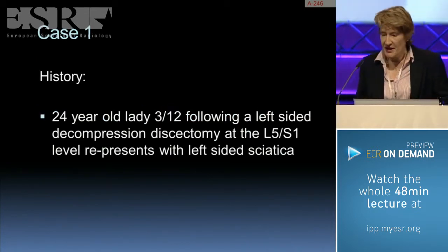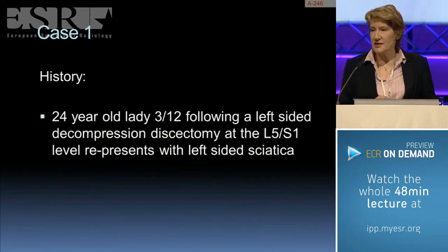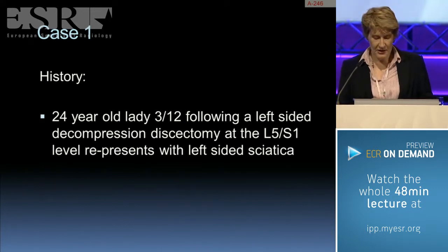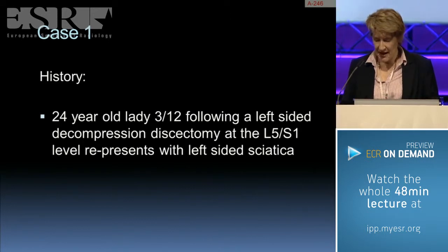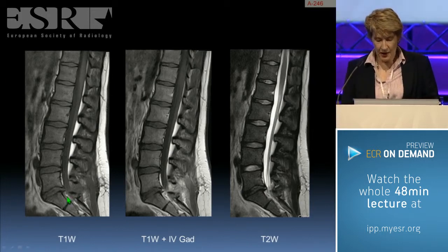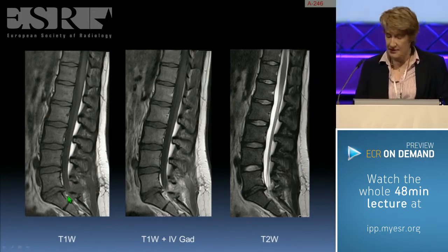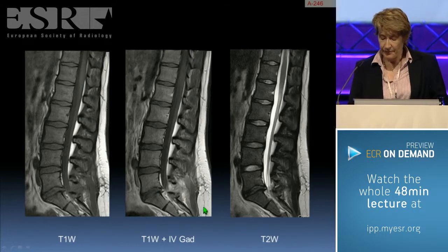The first case is a 24-year-old lady, three months following a left-sided decompression discectomy at the L5-S1 level, who re-presents with left-sided sciatica. Here you can see the sagittal T1-weighted image, the T1-weighted post-intravenous gadolinium, and the sagittal T2-weighted image.